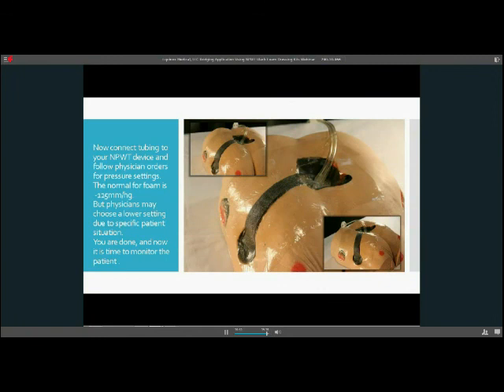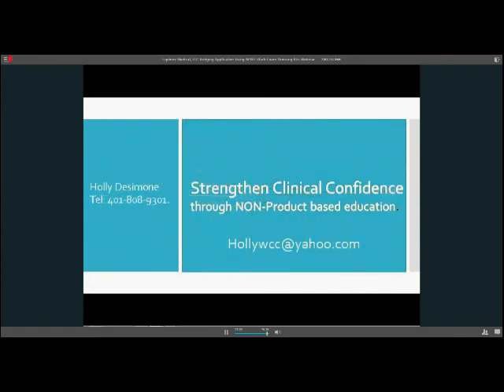But now you're done. Now it's time to monitor the patient. It's definitely time to get in and explain to your CNAs that it's a pretty important dressing. It's not done in a few minutes. So protect that tubing and protect from pulling along beds and things like that. And now it's time to monitor.